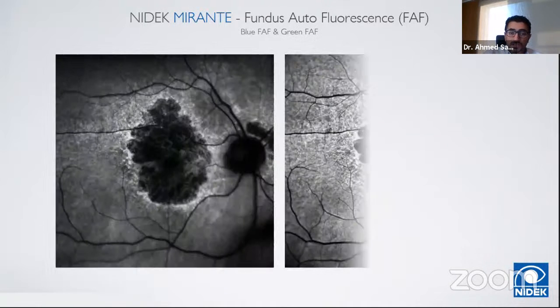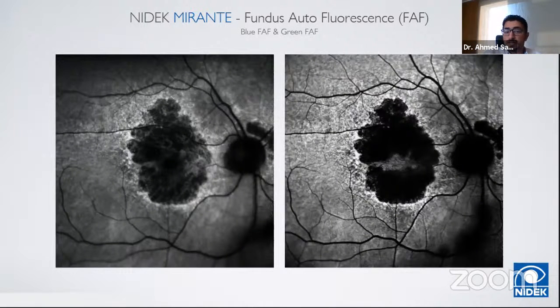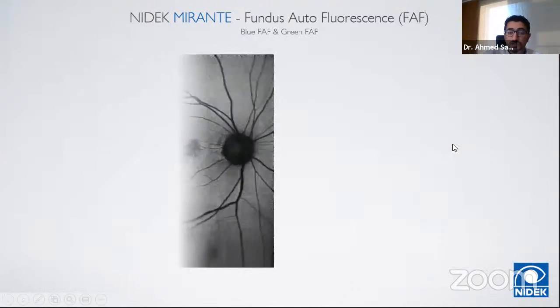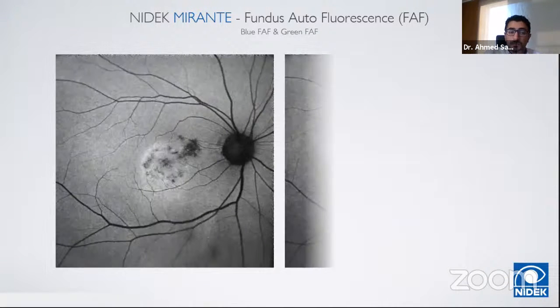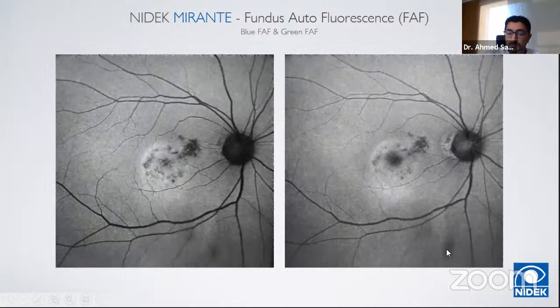In a couple of slides, I will share with you a couple of pictures. As you can see, these are pictures of the same patient, taken by the green and the blue. If we take a look, we'll be able to identify this one is taken by the blue laser, and it is noticeable through the optic disc being more clear compared to this picture, which is taken by the green laser.